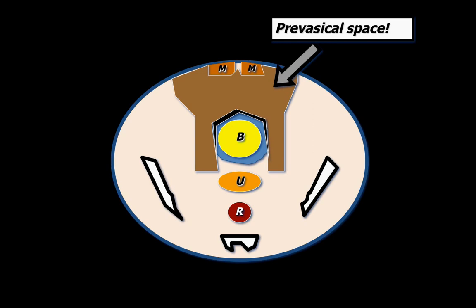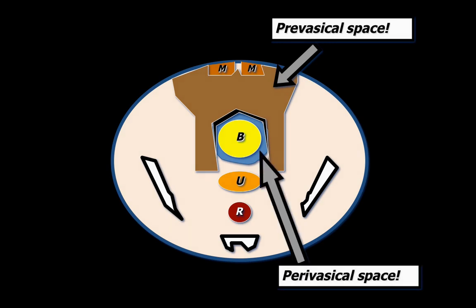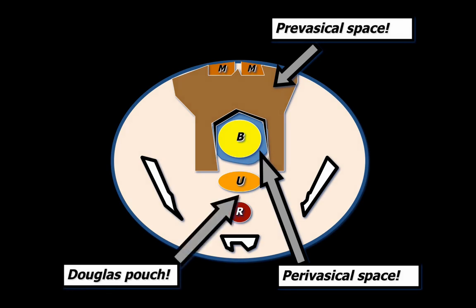The brown space anteriorly is called the pre-vesicle space. The blue space surrounding the urinary bladder is called the peri-vesicle space, and the very famous space between the uterus and rectum is known as the Douglas pouch or the recto-uterine pouch.